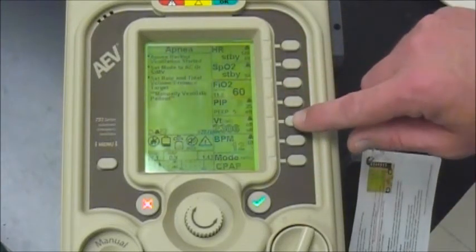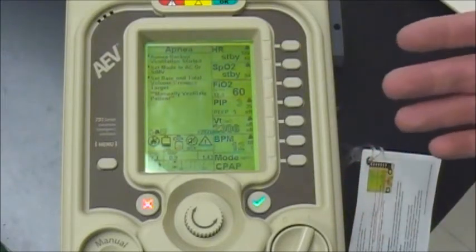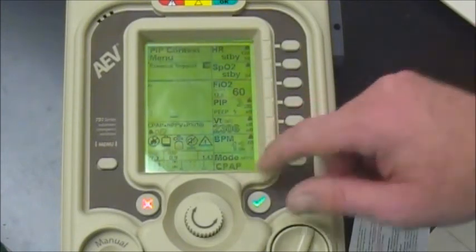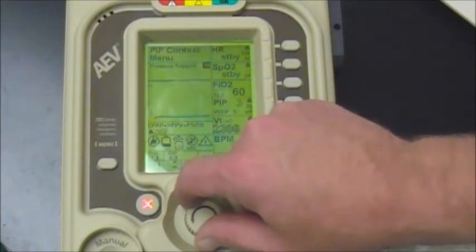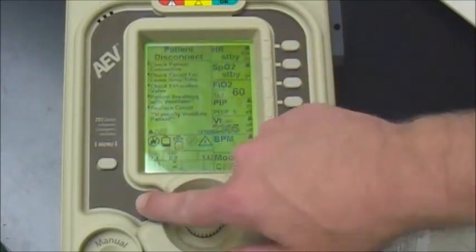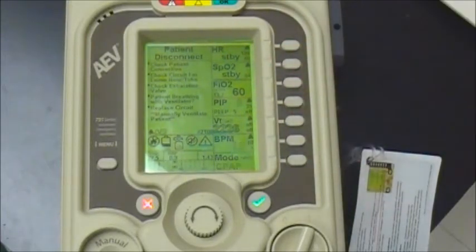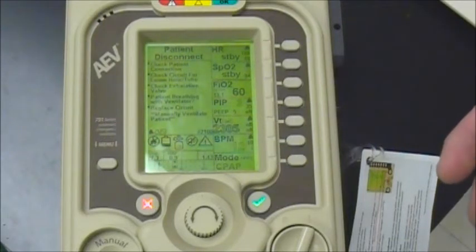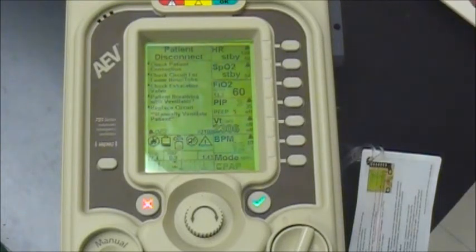If you want to change any settings and give them a little bit more, we never want to go to a pressure support above 25. But you can titrate pressure support up towards 12, 15, possibly 20 if you feel it's beneficial. Just remember that whenever you think of pressure support, you've got to add that to your PEEP setting — those together equal the total pressure going into your patient's pulmonary system. Be mindful of that so you don't increase intrathoracic pressure and cause their blood pressure to drop.